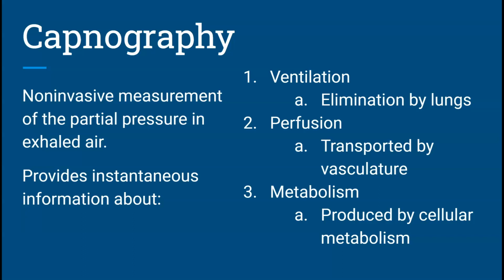And it also gives you a good sign of metabolism, like Rob said, DKA, right? So if you have a patient and they're unresponsive, they're hot, they're red, and their sugar is reading high, and then you intubate them, you would expect their capnography to be extremely high as well. Versus a patient who was hyperventilating, or you put them on blow-by end tidal for a panic attack, and you're going to find that their end tidal is very low because they're blowing a lot of that carbon dioxide off before it can really be measured.